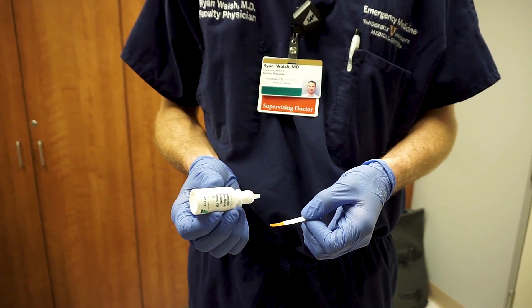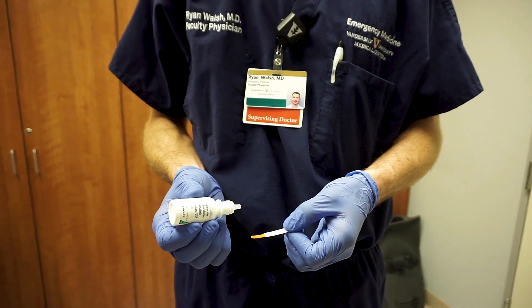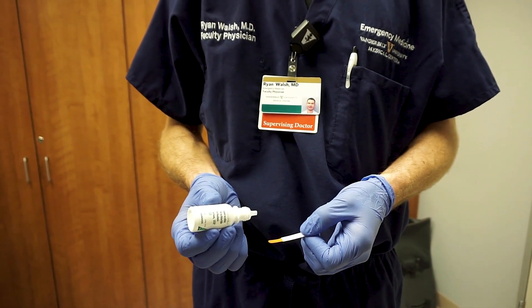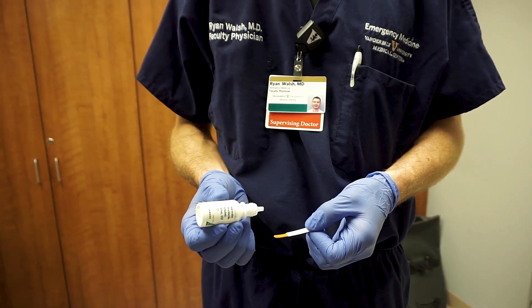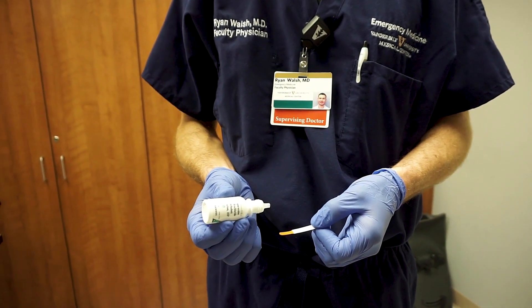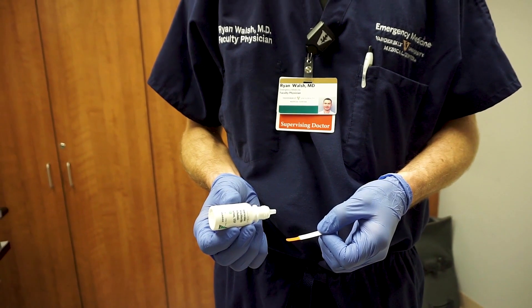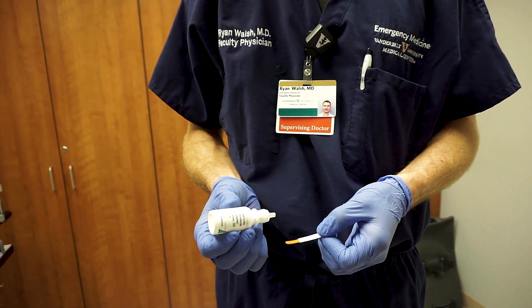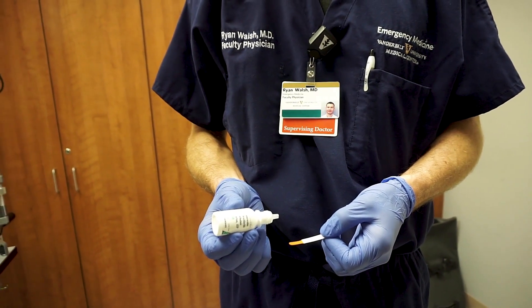Fluorescein stains and illuminates any portion of the cornea where the epithelium has been damaged. It typically comes on single-use strips but can also be present in multi-dose vials.